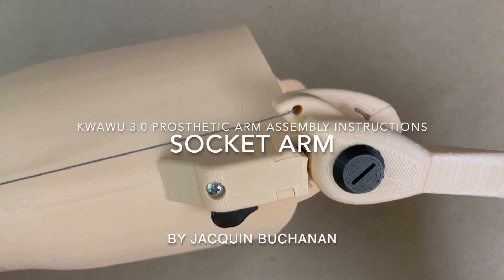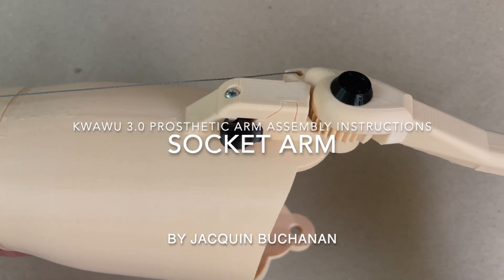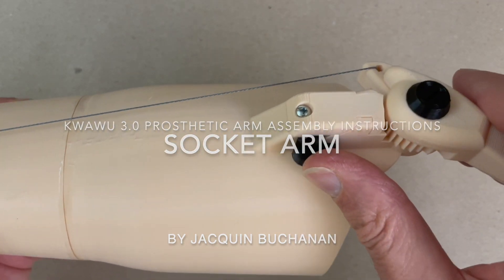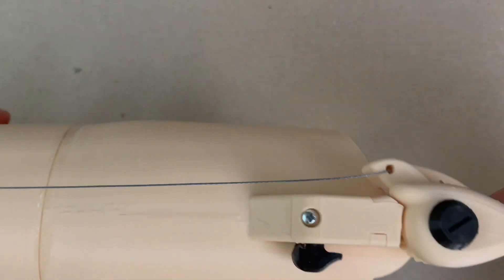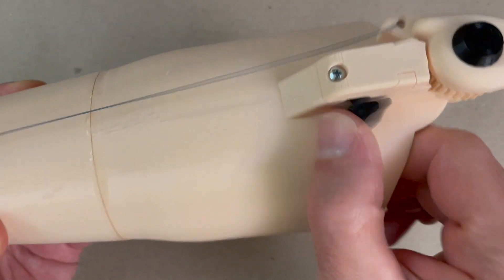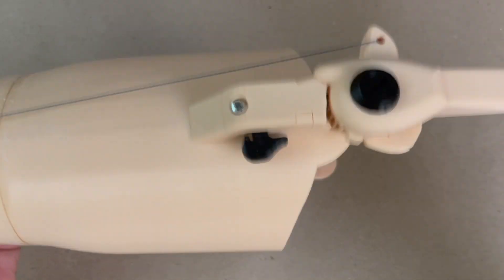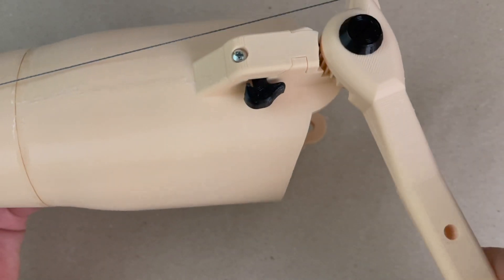Welcome to this video about the QuaWoo 3 socket arm. In this video, I'm going to explain how to basically attach the socket arm to the hand. I'm going to assume you've already assembled the hand with stringing from a previous video. In this video, we're going to put the arm together, attach the ratchet on the wrist, and pretty much have a complete functional arm by the end of this video.